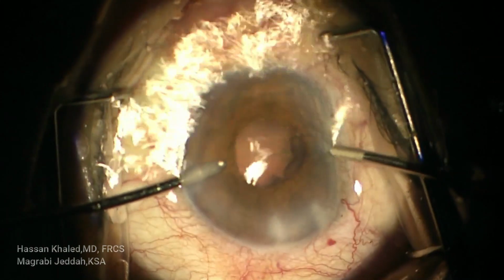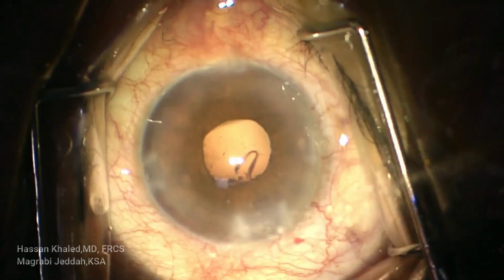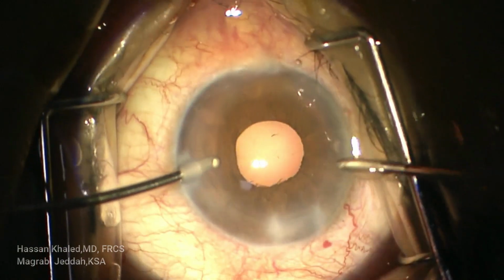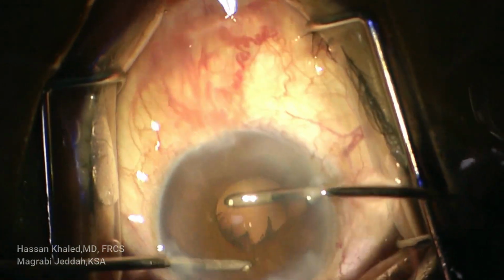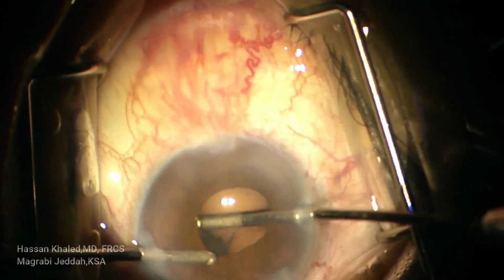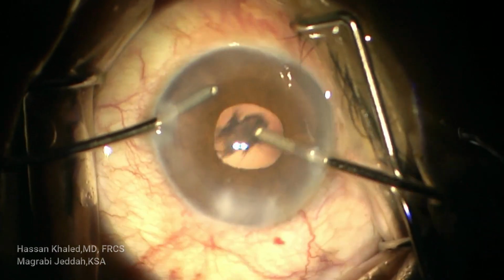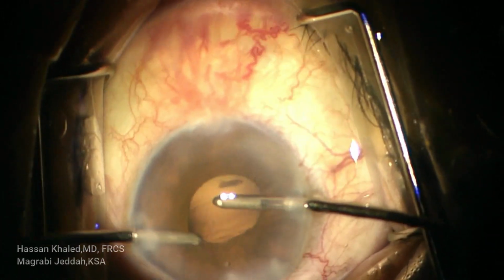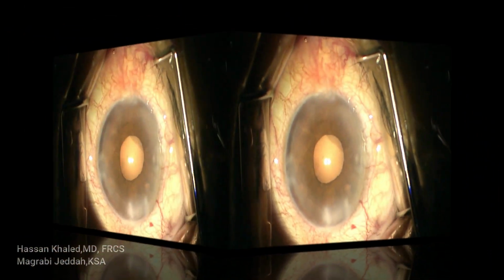You have to be careful while removing the cortex through the small pupil. Don't hold the capsule. You can form the anterior chamber and the capsular bag and go with the aspiration probe to hold the cortex, then peel it, then aspirate it at the center of the pupil. You can use the irrigation probe to push the iris away to see the cortex, to hold it and aspirate it with the aspiration probe. As you see, you can hold the cortex and peel it and aspirate at the center of the pupil. You can see now the pupil diameter, it's about 2.5 millimeters.